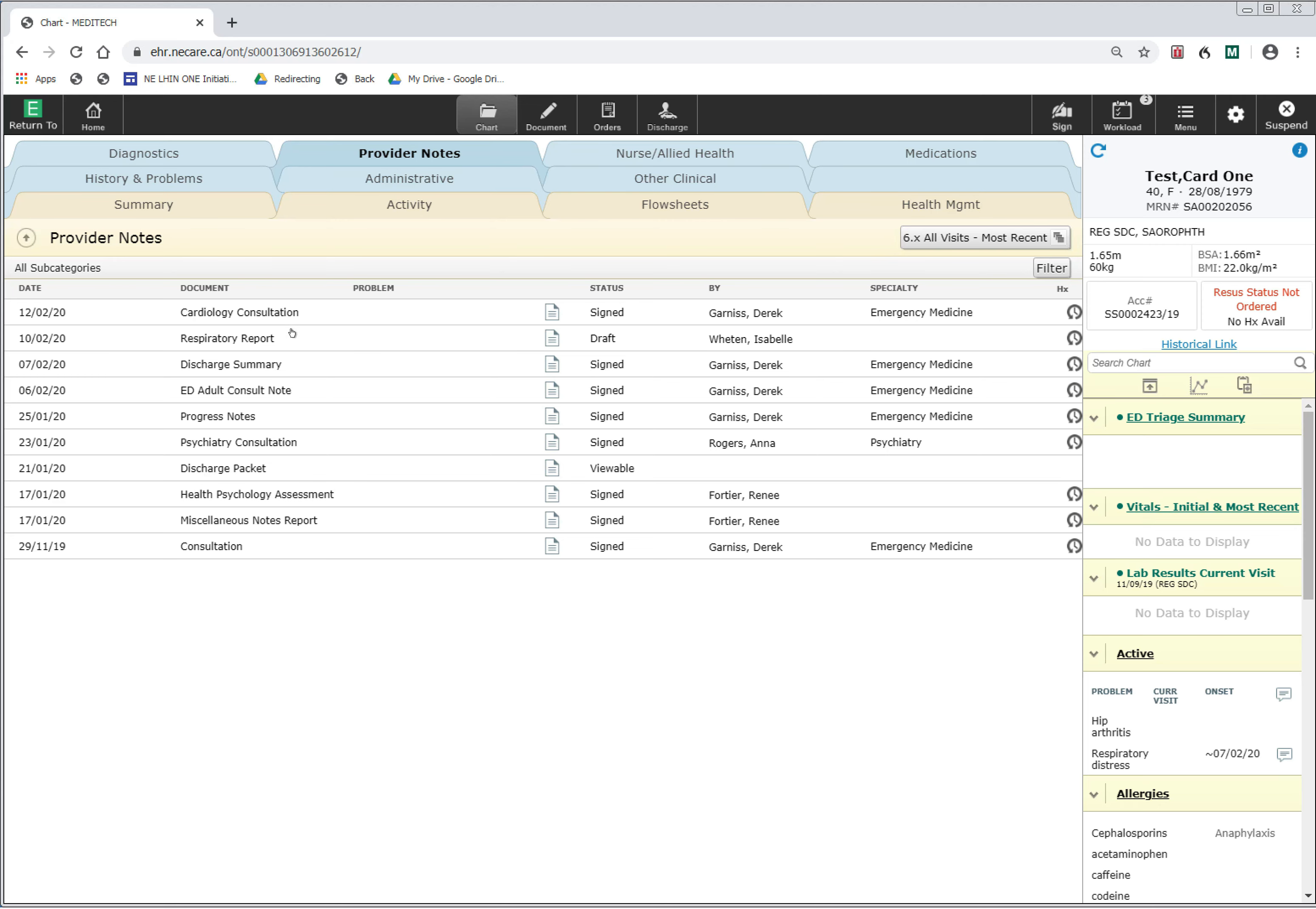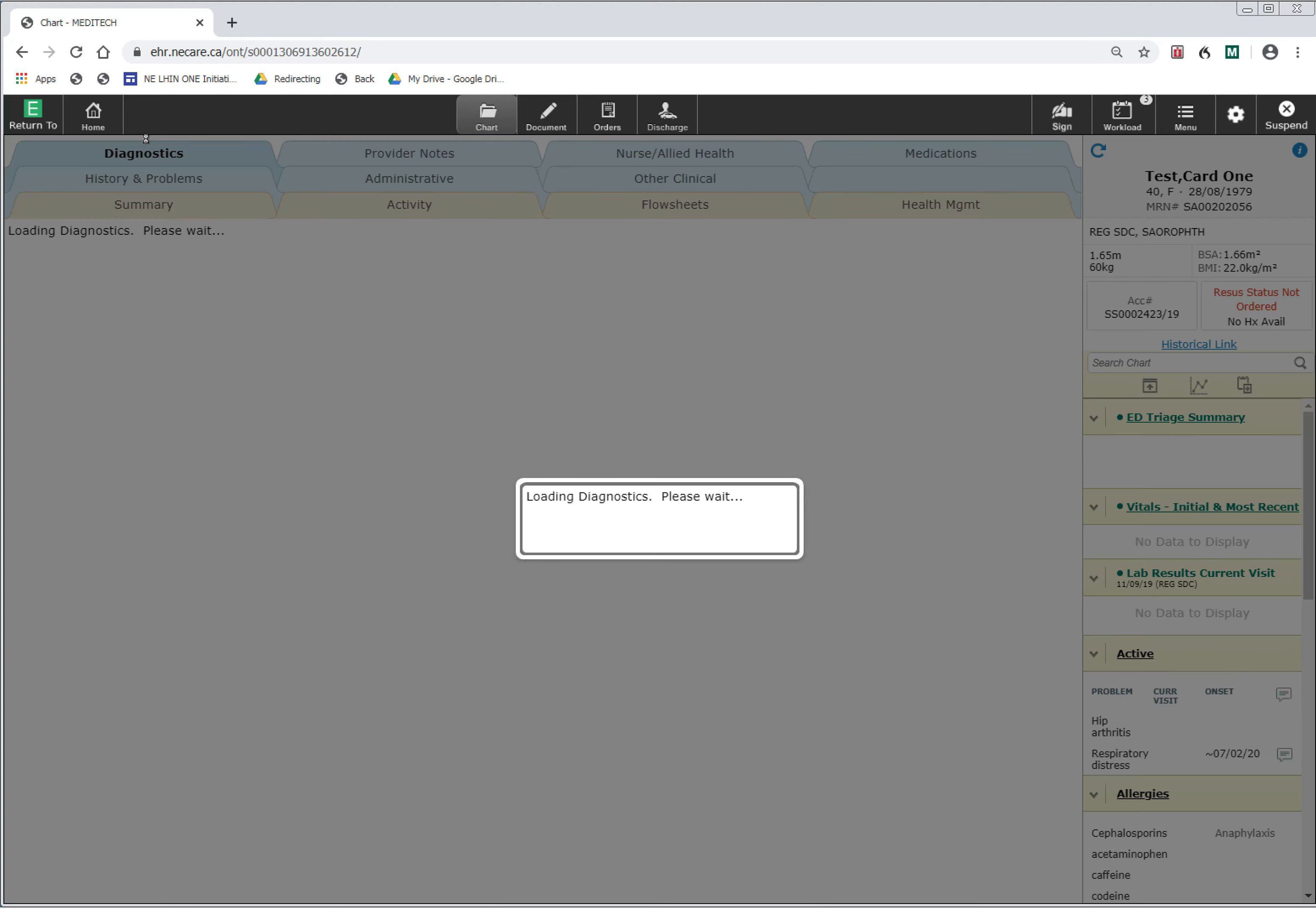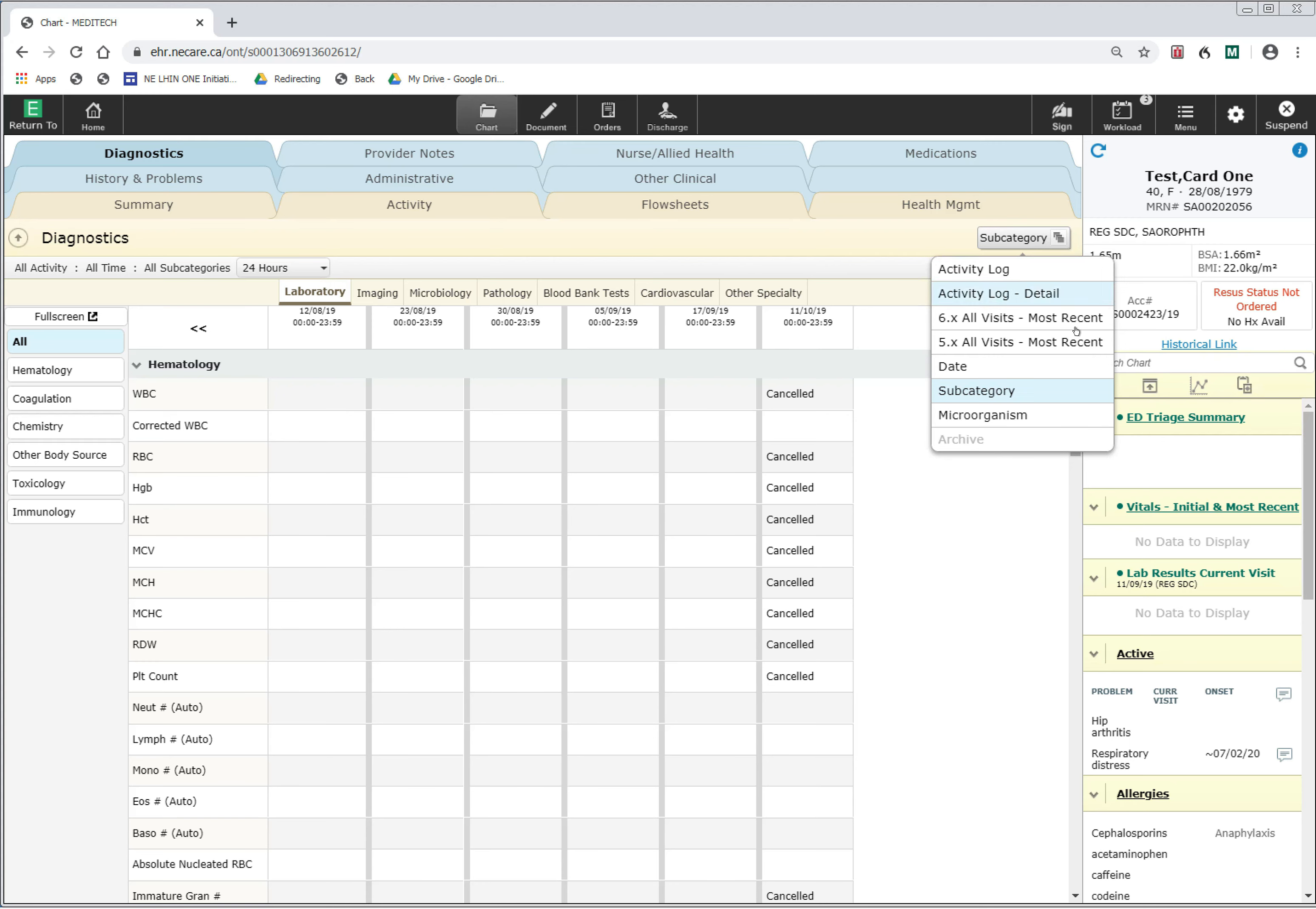The same is under the Diagnostic Imaging tab. The default is to the current data in the new Meditech system. If you would like to look at imaging and diagnostics from the old Meditech system, by clicking on the subcategory button that you see here, you will notice that the 5.x All Visits is highlighted.